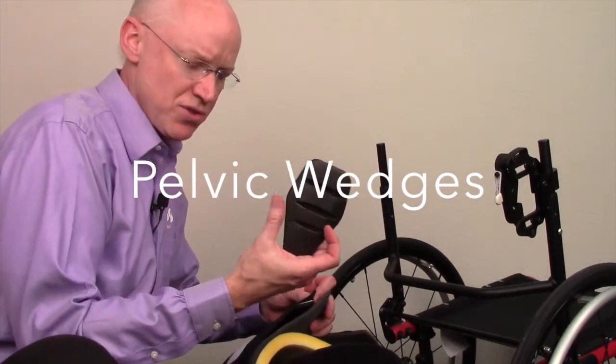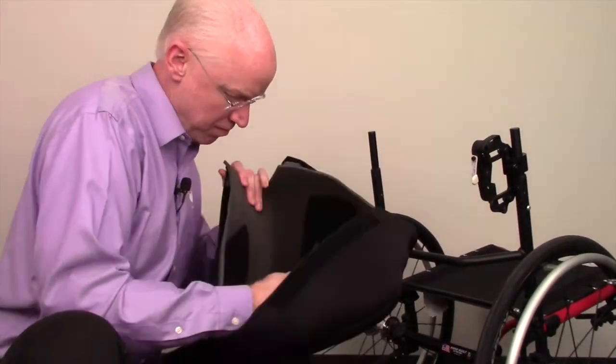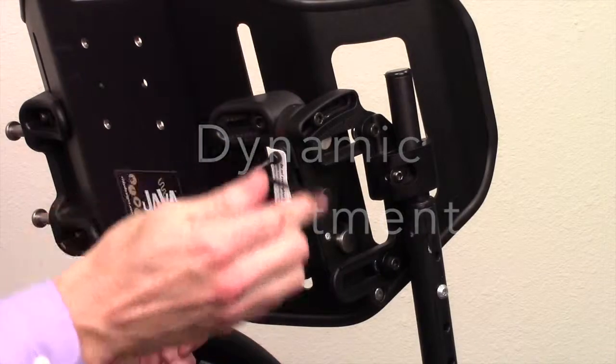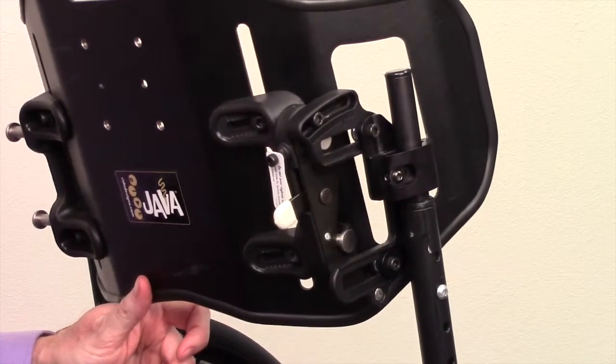Lateral pelvic wedges. Dynamic adjustment. Back this screw out to introduce 7 degrees of dynamic movement.